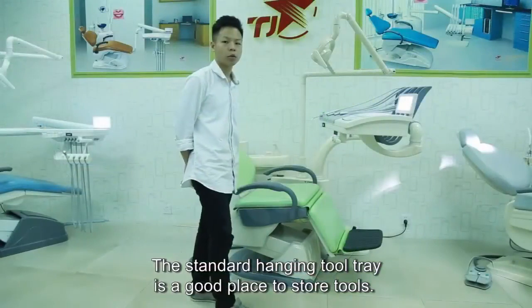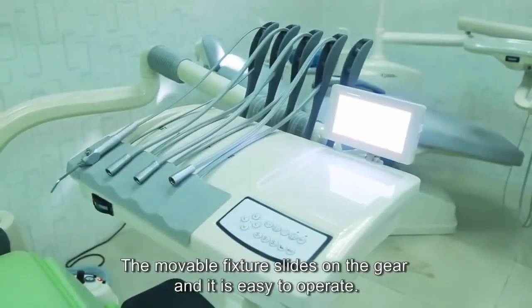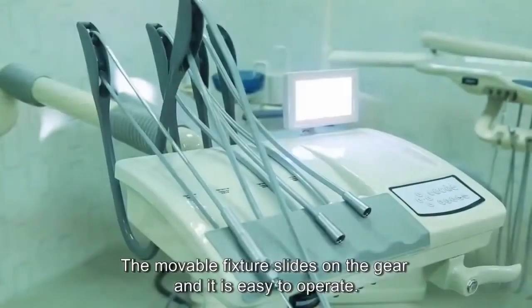The standard hanging tool tray is a good place to store tools. The movable fixture slides on the gear and it is easy to operate.